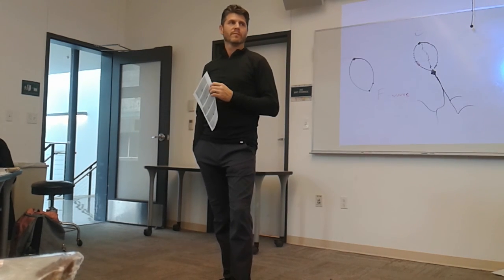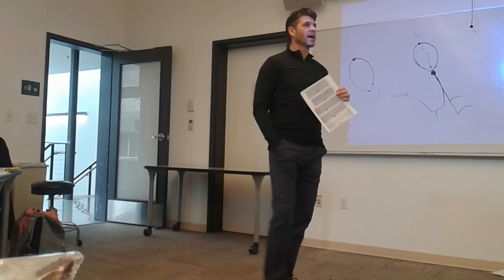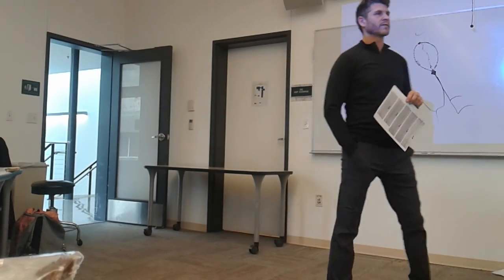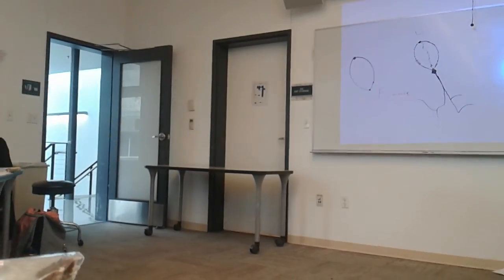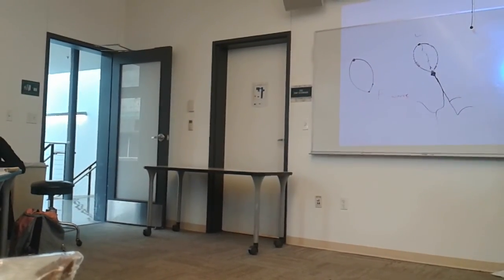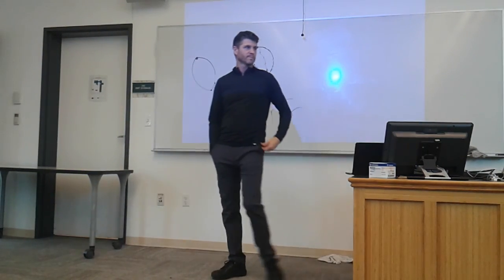Is that where you see like 4 to 1 and then 3 to 1 and then 4 to 1, you might have 5 to 1? Yep, it might be all over the place. In which case you call that variable conduction. So name the conduction if you can, and if you can't because it's all over the place, then you would say it's variable conduction.